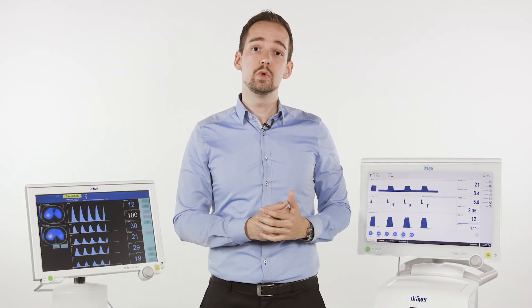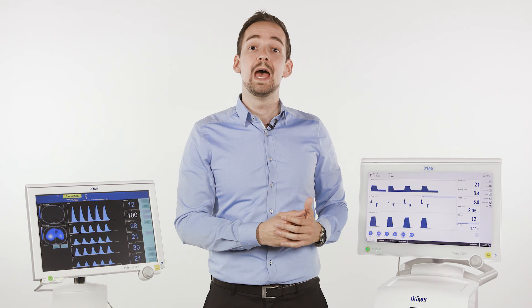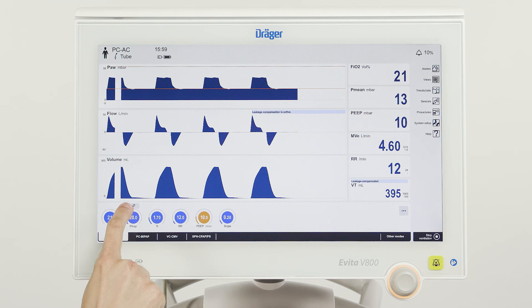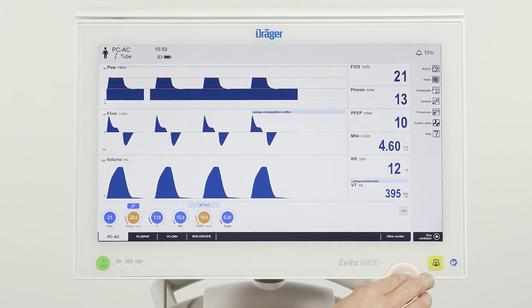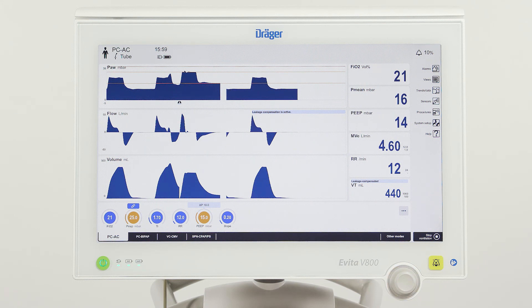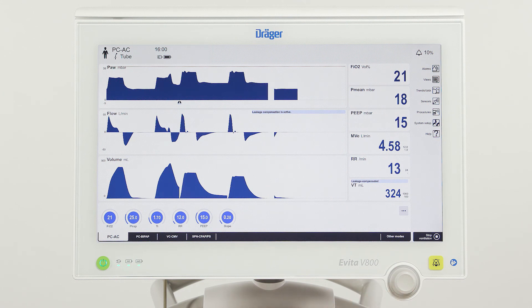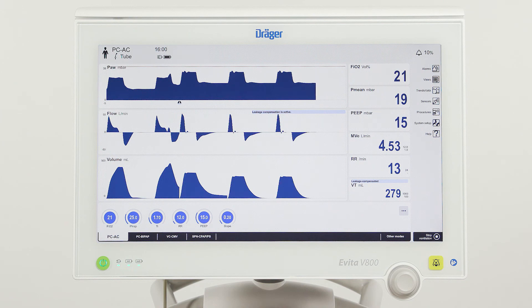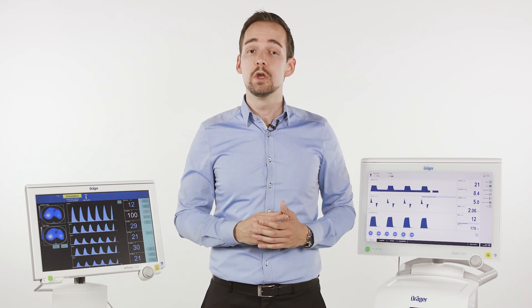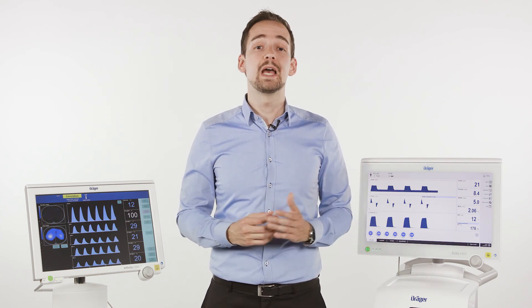For this analysis we choose pressure control ventilation and use the function Pressure Link and Quick Set. In order to gradually open the lung, we can stepwise increase the PEEP level in steps of 5 millibar. We can use Pressure Link and Quick Set to keep a constant driving pressure and apply the increased PEEP levels immediately. During this recruitment phase, we have to closely monitor the patient's condition, for instance the patient's cardiovascular status.